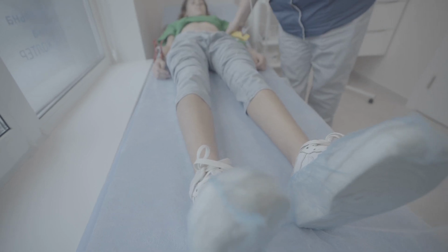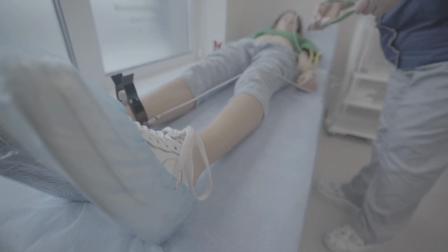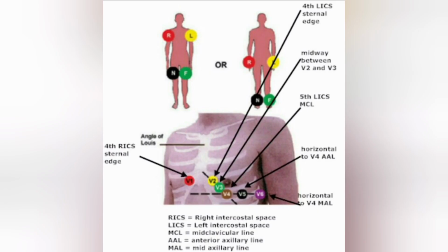How to perform an ECG in the hospital and physician clinic. ECG is a common and routine procedure performed in both hospitals and physician clinics to assess the electrical activity of a patient's heart. The process of performing an ECG is relatively straightforward and typically follows these steps.